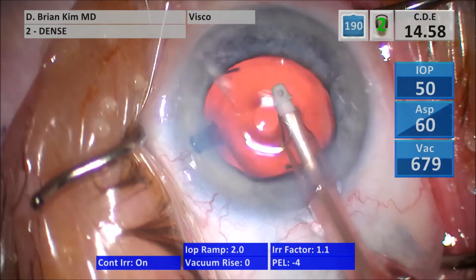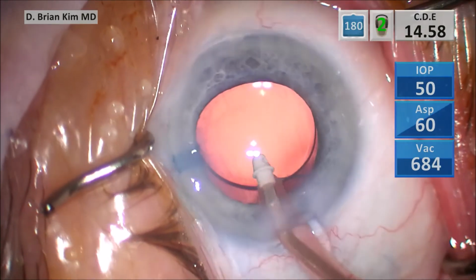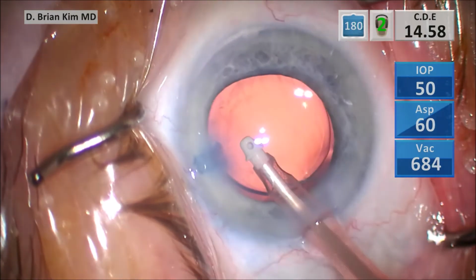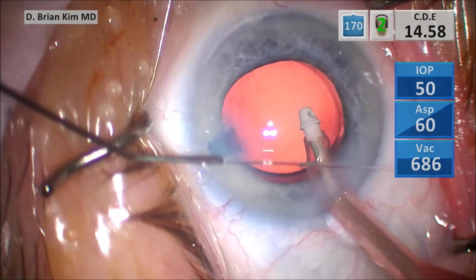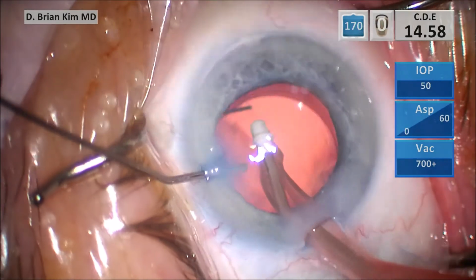So again, this is a super dense lens, hypermature cataract, a Catarock. I perform terminal chop, again, by debulking the central core. This reduces the risk for a posterior plate. And then you don't want to crack from the top like the standard stop and chop. That makes no sense to me. It never did. Because if you're cracking from the top, it's like trying to crack Pac-Man's teeth. You want to crack his jaw, which is in the back.